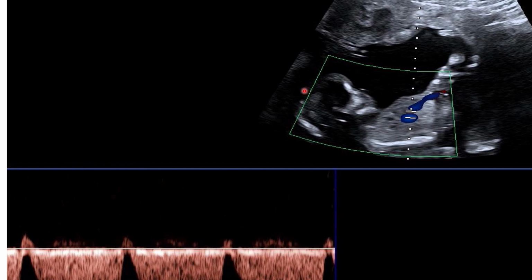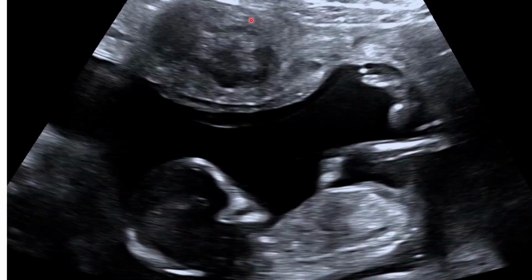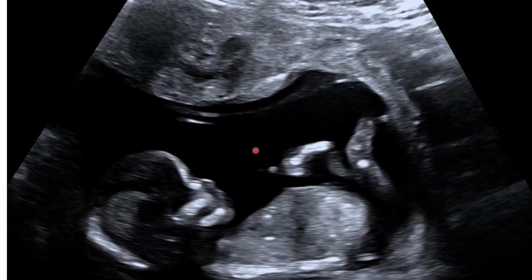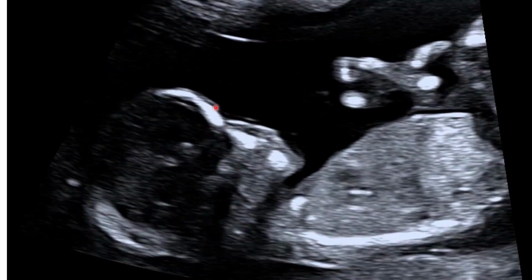and then they can also cause challenges with pain during the pregnancy. So this one is small, so it's not really interfering with the pregnancy, but it can cause some intermittent pains. So here is the fetus.